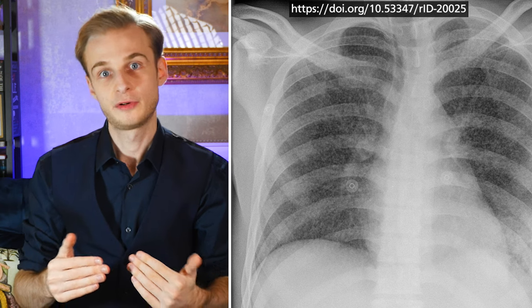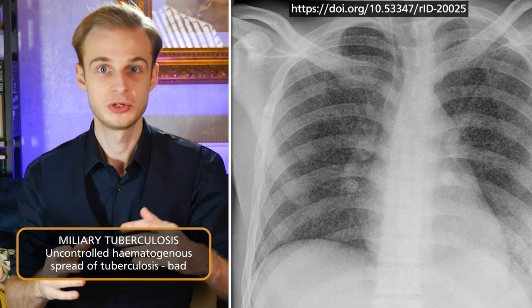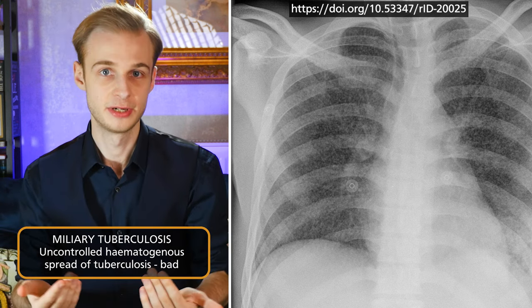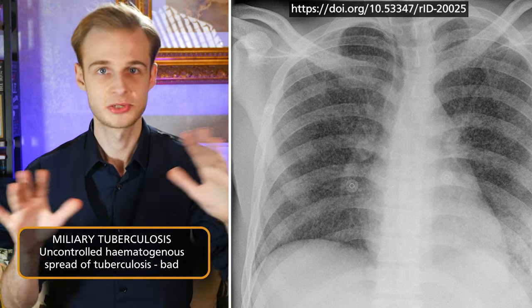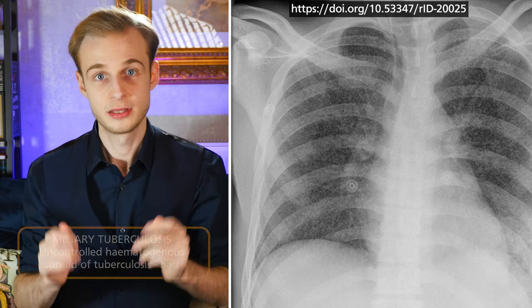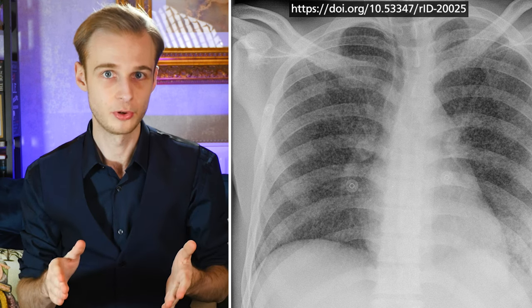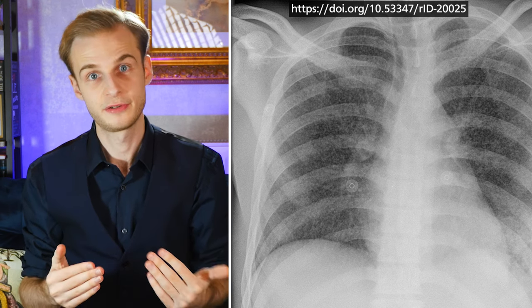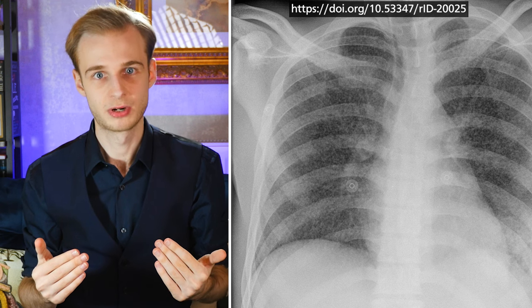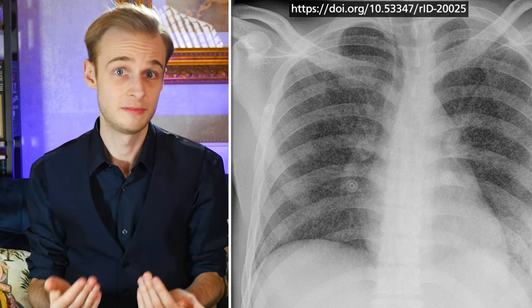The second pattern to look out for is miliary tuberculosis, which refers to widespread hematogenous dissemination of the tuberculosis bug. You can see small, uniform deposits all throughout the lungs. The prognosis if a patient reaches this stage is generally quite poor, and although this is becoming increasingly rare, it's still one that will prompt an 'oh dear' when you come across it in practice.